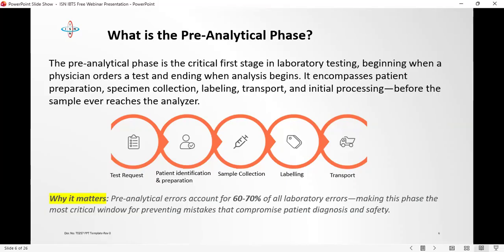Let me give us an example. A patient potassium result comes out extremely high, something like, let's say, 6.5 or 7.0 millimole per liter. Now, if you're not practicing good laboratory practice, the tendency is to immediately report that result, especially if the analyzer did not flag any error. People think, oh, since my analyzer is not flagging error, that means the result is okay. But a more experienced, good laboratory practice driven professional will pause and ask questions.